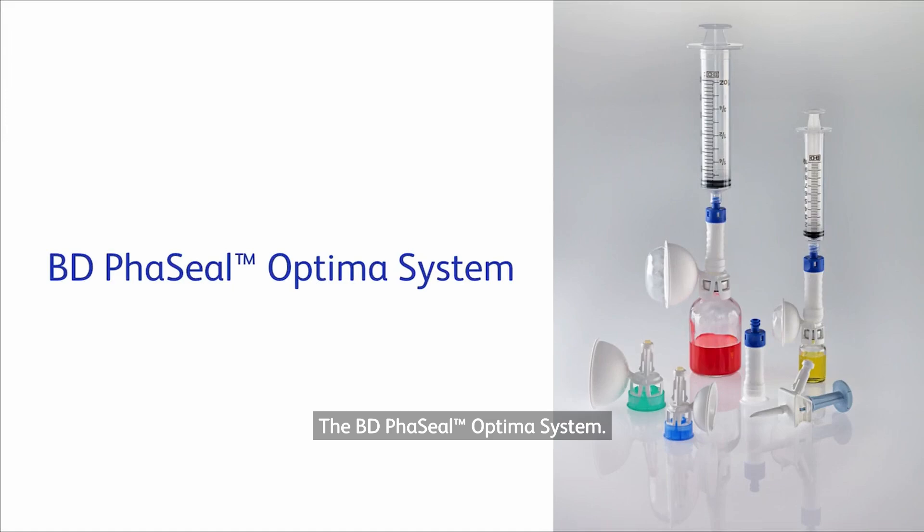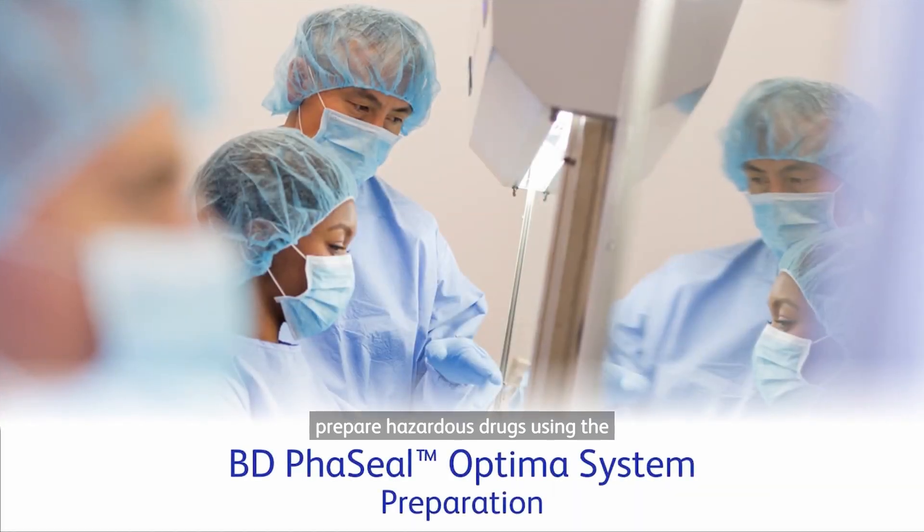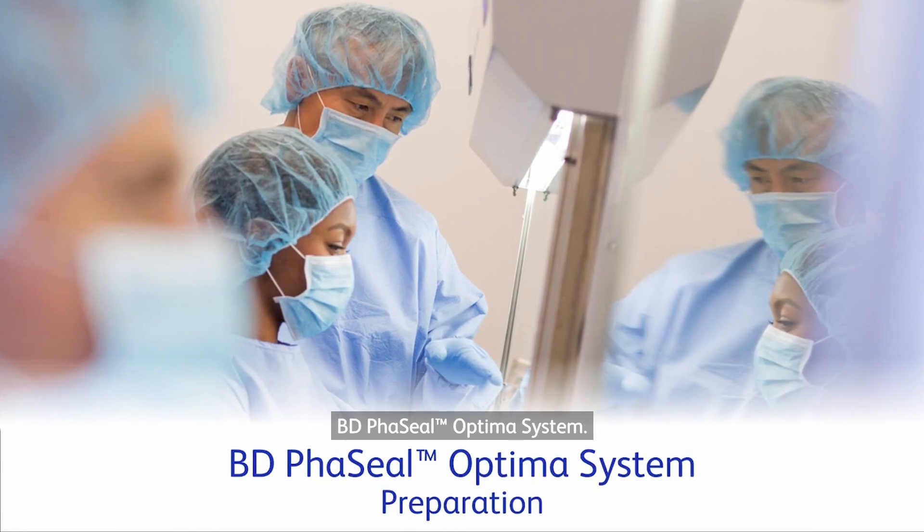The BD PhaSeal Optima System. This video is intended to be a supplement to the BD PhaSeal Optima System instructions for use. Please consult the instructions for use before using the system. The following video describes how to prepare hazardous drugs using the BD PhaSeal Optima System.